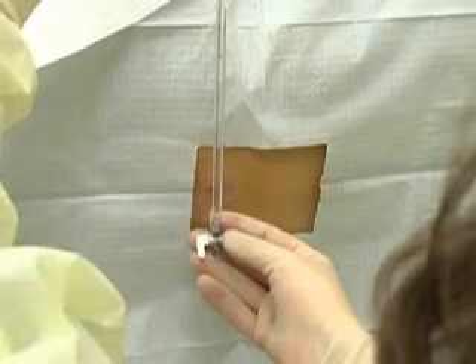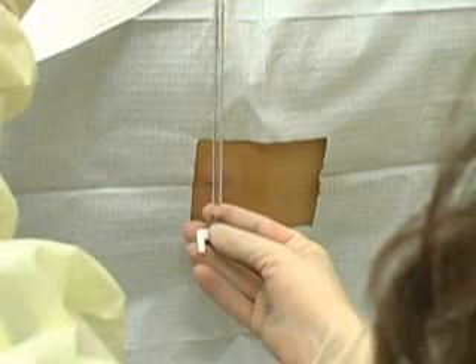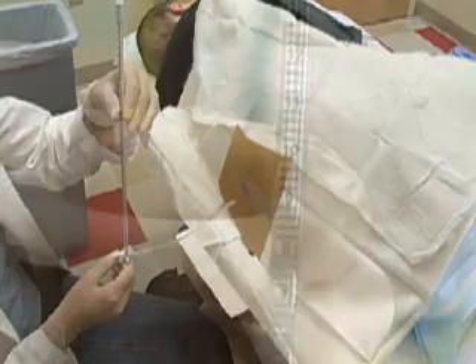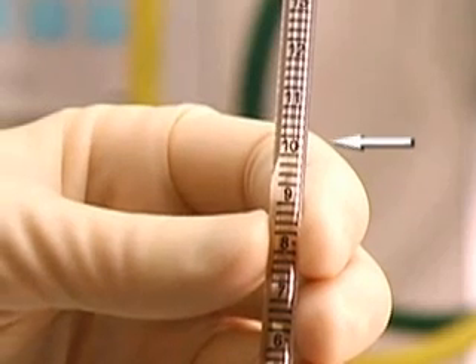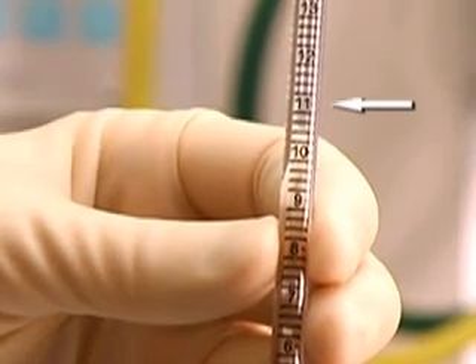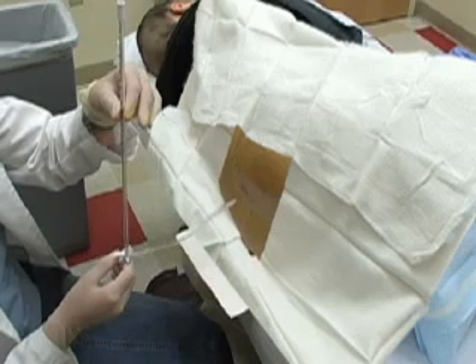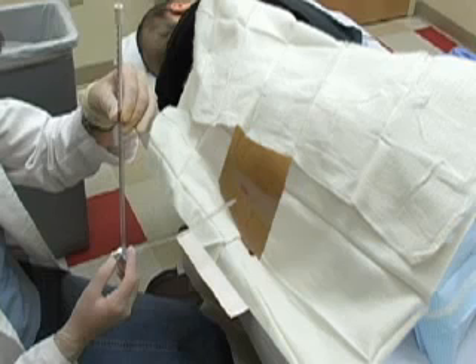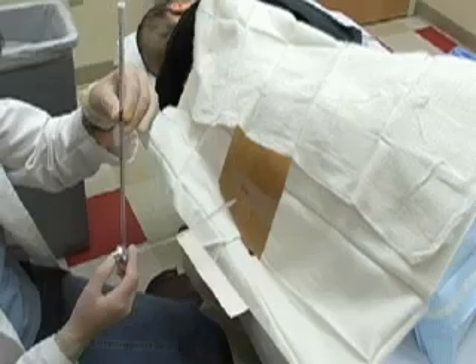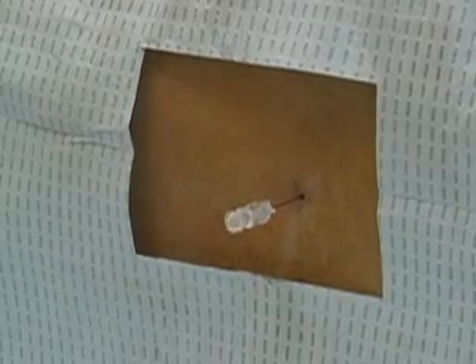To obtain an opening cerebrospinal pressure, the patient must be in the lateral recumbent position. Use a flexible connector and attach a manometer to the hub of the spinal needle. After waiting for the column of fluid to rise and possibly seeing pulsation from cardiac or respiratory motion, you may take a measurement. If the cerebrospinal fluid pressure exceeds 25 centimeters of water, you should closely monitor the patient for signs of herniation and determine the cause of the elevated intracranial pressure. You must allow cerebrospinal fluid to drip into the collection tubes.